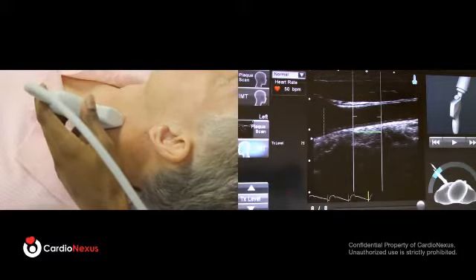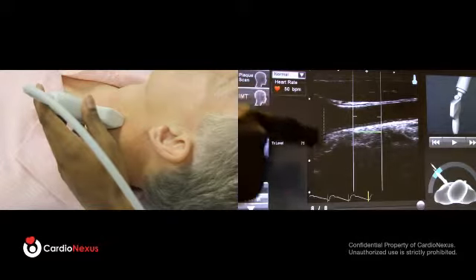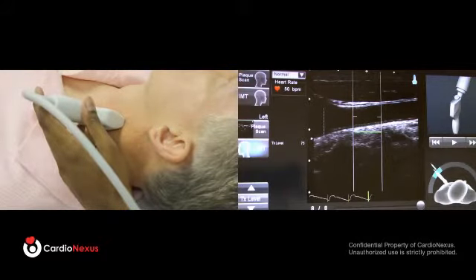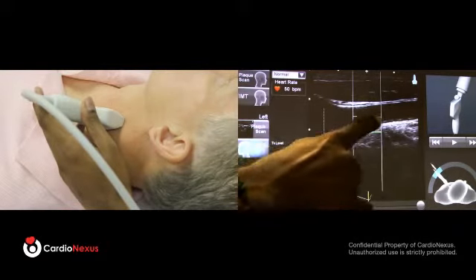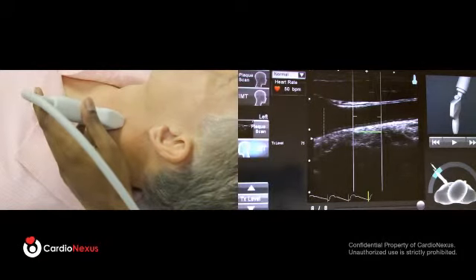The second check, which is the more important check, is to see that the dotted line on the left side of the ultrasound screen, this line here, lines up with the widest part of the artery, or at the flow divider if you can see it. So keeping your eye on the diameter of the artery from the right side of the screen, you can see that the artery opens up here. However, it's not quite in the widest part, nor can I make out a flow divider on the left side of the screen.